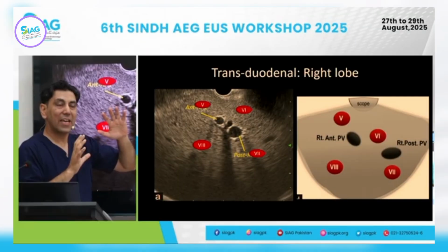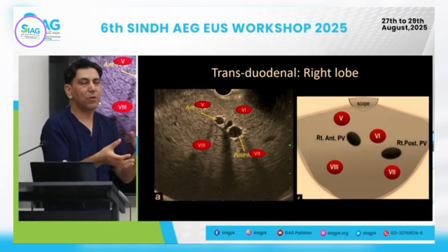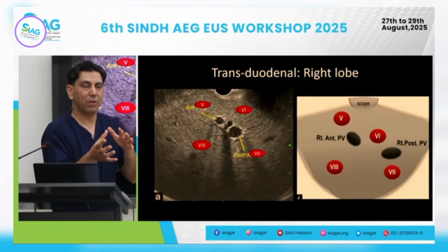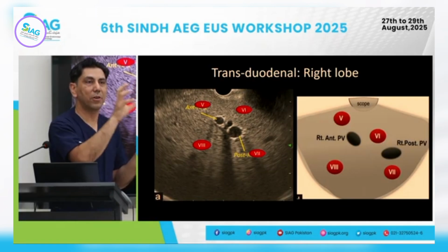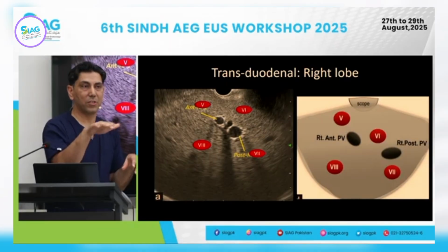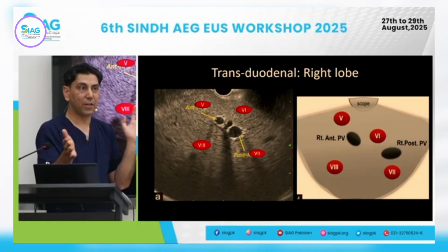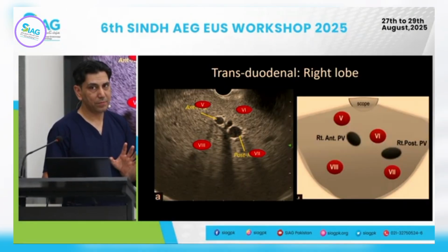Okay, so we're talking mostly about pattern recognition. Get your eyes accustomed to this pattern recognition first. There are lots of pieces of the jigsaw here, and then you can start to put it together: how the portal vein branches are dividing into superior and inferior segments, how hepatic veins are dividing into the left, lateral, and medial segments. Okay, so far?